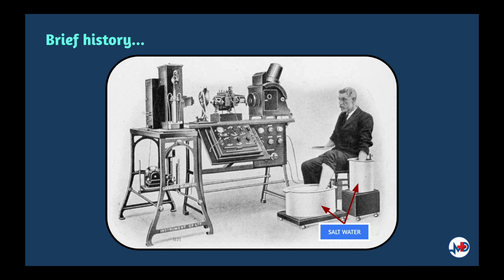In 1895, William Einthoven assigned the letters P, Q, R, S, T to the deflections in the theoretical waveform he created using equations which corrected the actual waveform. When a more precise waveform was obtained using the string galvanometer, which matched the corrected capillary electrometer waveform, he continued using the letters P, Q, R, S, T, and these letters are still in use to date.